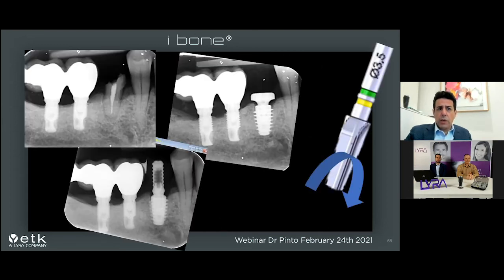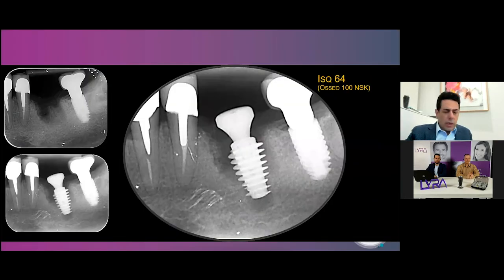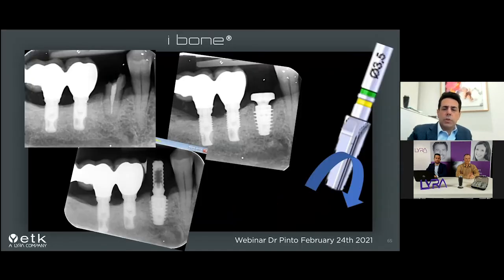On this post-extraction, we can put the implant directly, and we can use a tool that we will describe after, a reamer, that can help you to condense the bone and augment the primary stability, without reducing too much bone. And you see that even with a short diameter, we can provide for this implant, I think I forgot pictures, this was with the temporary crown. So we made immediate loading because we get a very good primary stability, so we can put the temporary crown immediately.